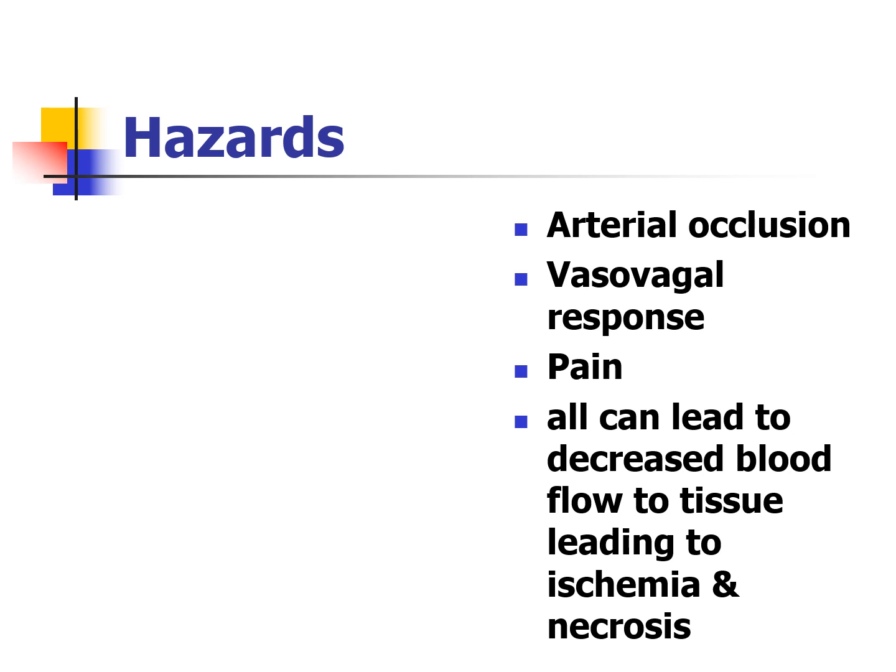And so you're going to build up that blood gas skill pretty easily, pretty fast. And so you'll get pretty good at it. So some of the hazards that you have to look at is the spasm of the vessel. That's going to be one of the big ones. Because there's nerve intervention to your arteries, now remember there's not to veins, but there's to arteries, you can have a spasm to the vessel itself and cause the vessel to constrict, and therefore makes it a smaller target, which means it's harder to hit.